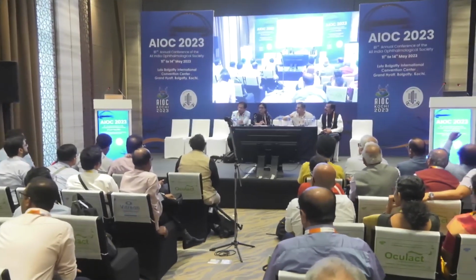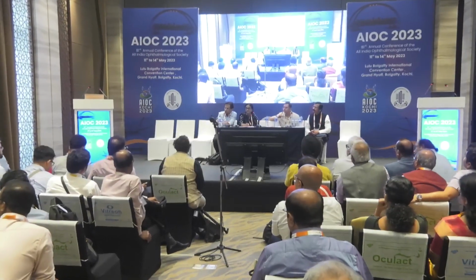Okay, I think the pneumatic is the best. There is no question about it. Whatever highest your machine can afford, that you have to set. Minimum, with the Reticare that Dr. Heralgi showed, the maximum I can go up to is 900. So that's what it is. If you go for a higher cut rate, it will be easier.